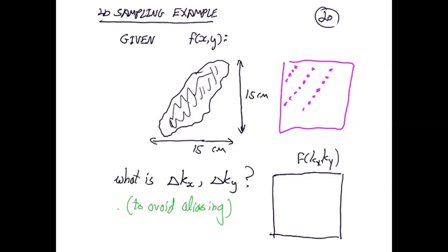And less fine in the other dimension. Crazy, huh? So obviously you can see that there's more degrees of freedom here. And if I have that type of scan, I would actually prescribe what's called an oblique scan, where I'm not going to choose the axes, but I'm actually going to choose this as the axes, because sometimes it would allow me to reduce my sampling.